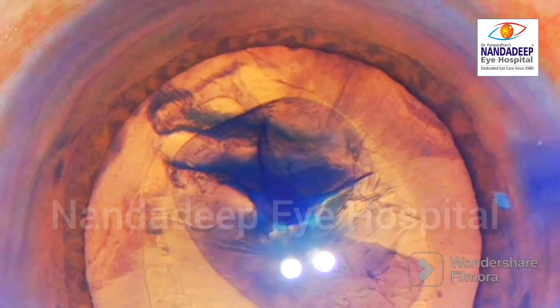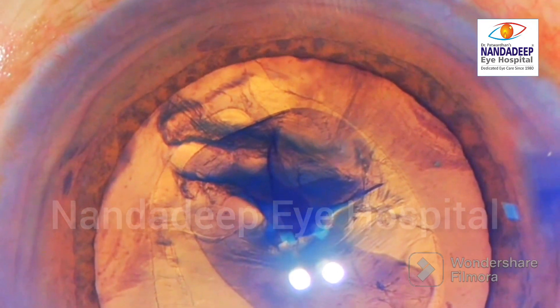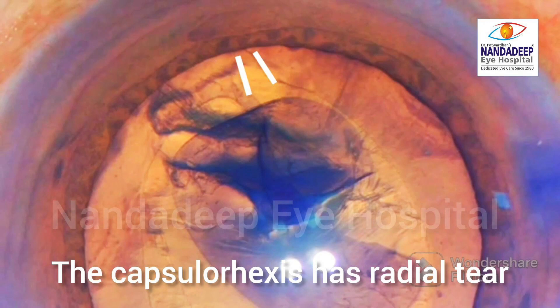So during the rhexis, the trainee extended this capsulorhexis — there was a radial tear and how will you proceed. Watch this tear very carefully. Though it is a radial tear, if you imagine these two lines, they don't go and extend beyond the equator of the lens.